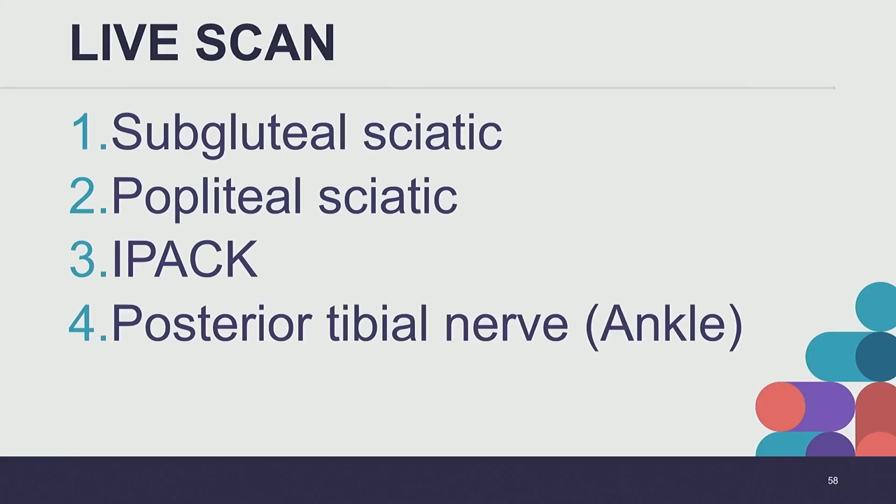We're going to put this down. Go back to, perfect. So we're just posterior lateral to the medial malleolus. If we could go up to the screen now.